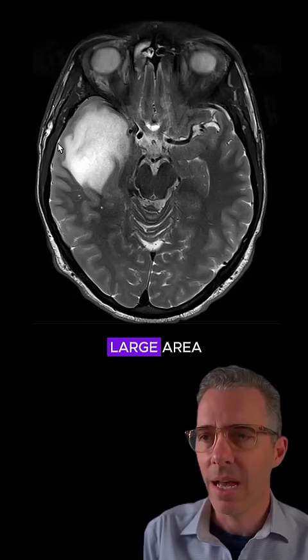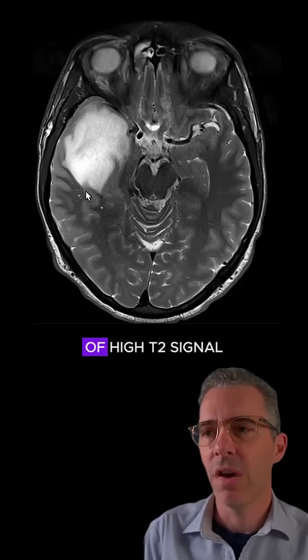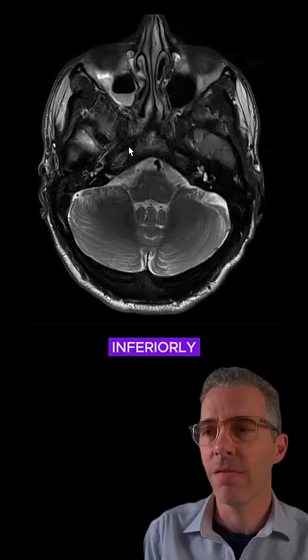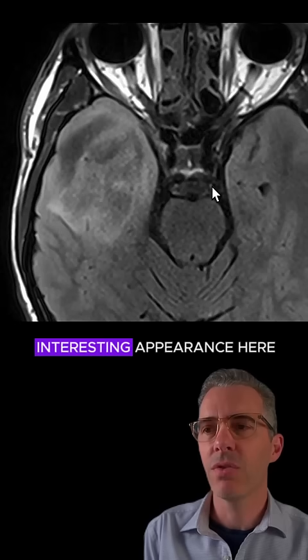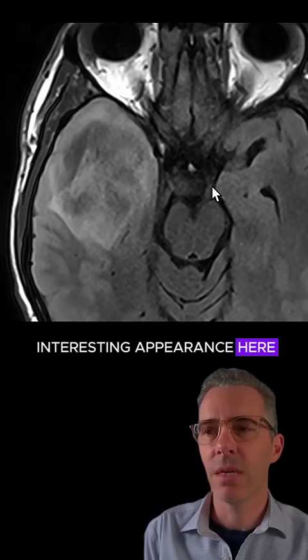What we see here is a very large area of high T2 signal, extending all the way inferiorly. Now, when we move over to FLAIR, we see quite an interesting appearance here.